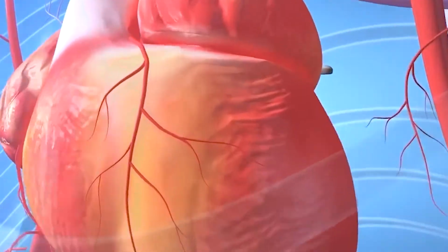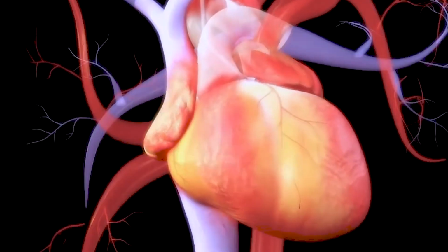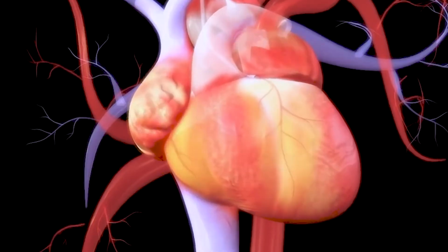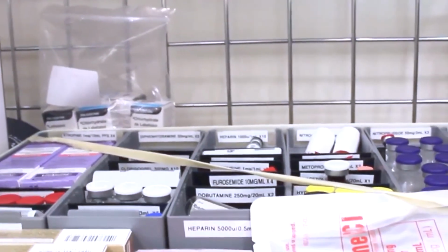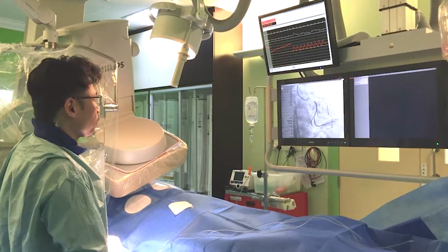Once that is done, blood is restored to the coronary arteries. This entire process is called a balloon angioplasty procedure. The procedure itself, as I said, is simple and is done under local anesthesia. The patient is wide awake and it is often completed within 15 to 20 minutes.